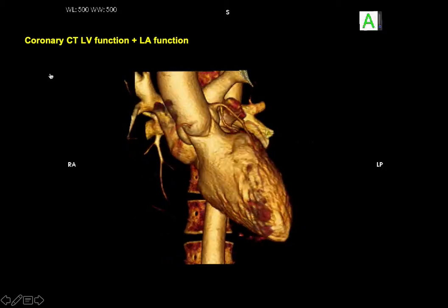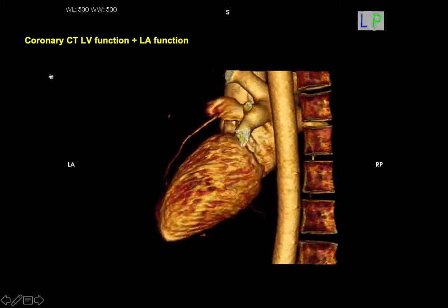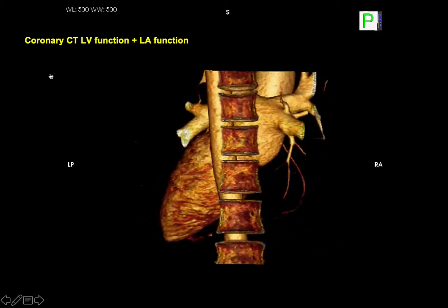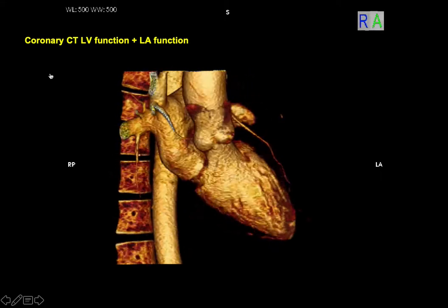So you could tell, at least, for example, here, what is the ejection fraction of that little chamber? Is the atria contracting in a uniform, reasonable way, such that there are nice flows occurring in that chamber?